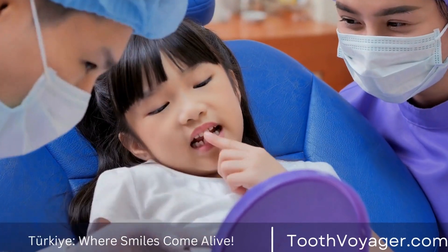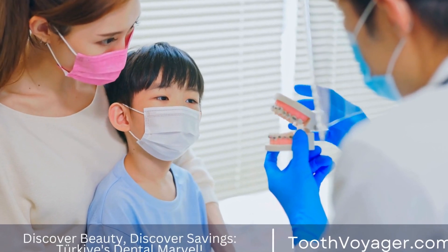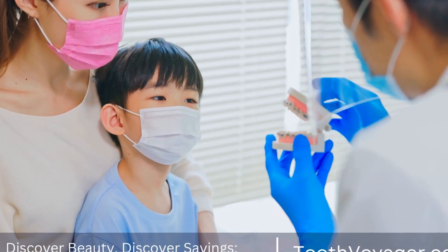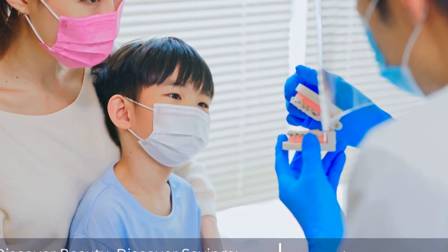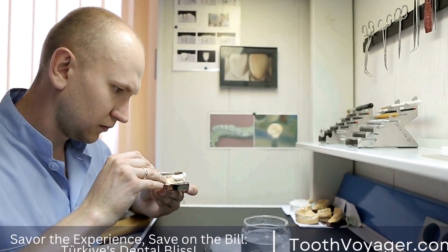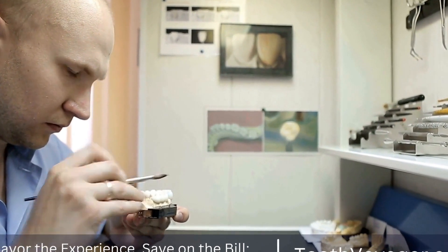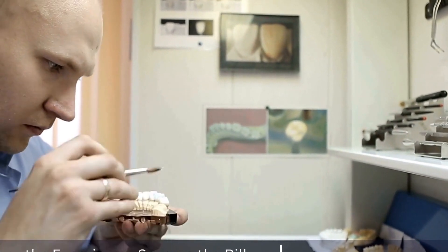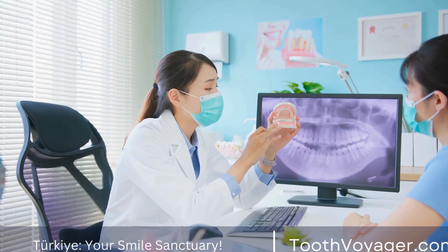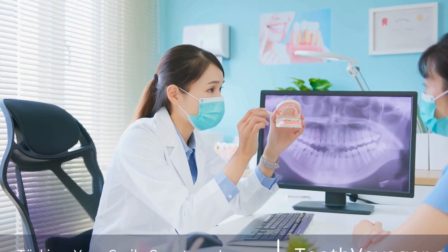Digital Smile Design. Digital Smile Design is a revolutionary concept that allows patients to see a preview of their new smile before any treatment is done. By using digital imaging software, dentists can show patients different treatment options and simulate the outcome of each one. This helps patients make informed decisions about their dental care and gives them a clear idea of what to expect from the treatment.